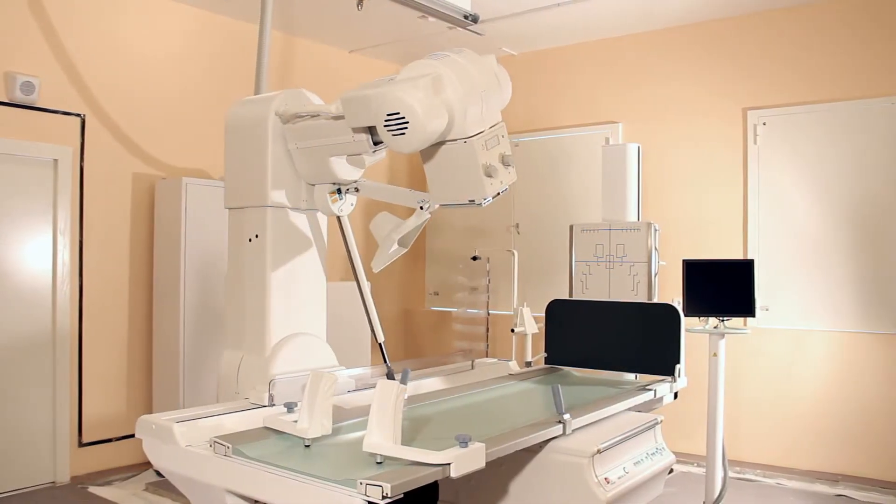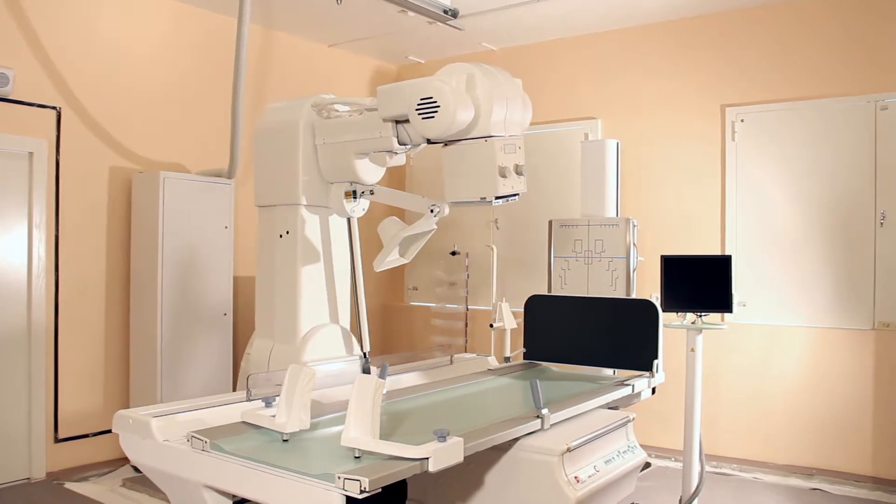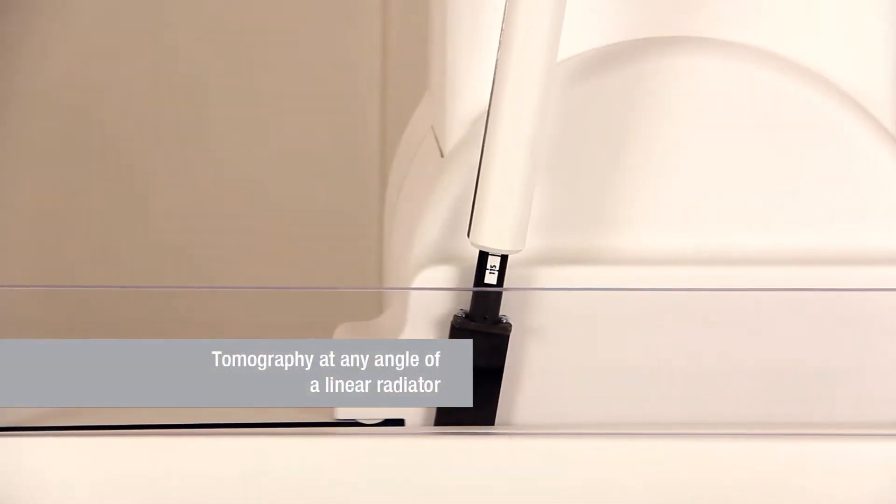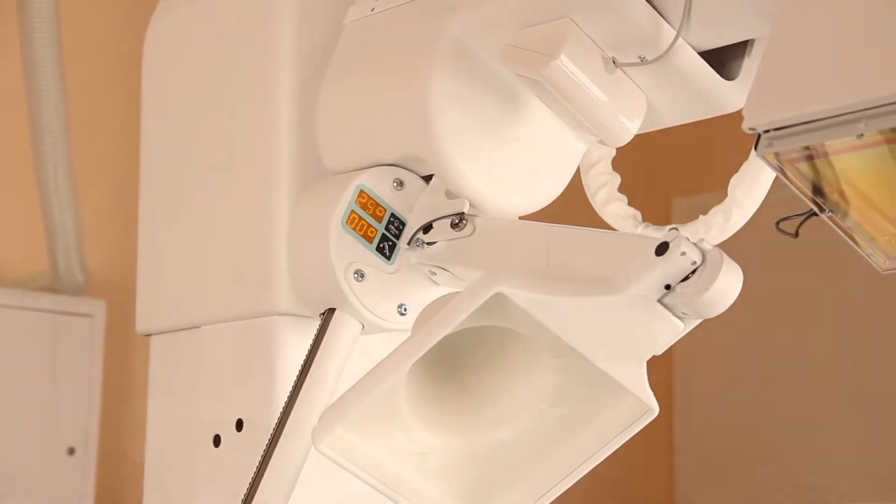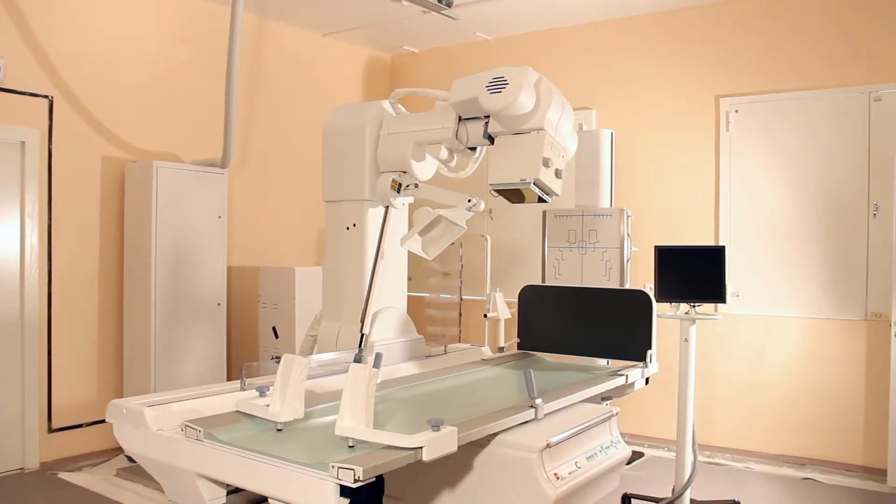The range of the scanning device movements is so wide that any anatomic area, even of obese patients, can be examined without shifting the tabletop.